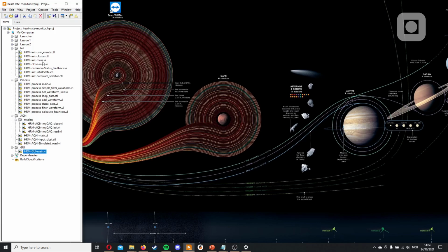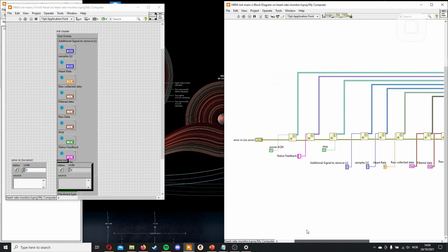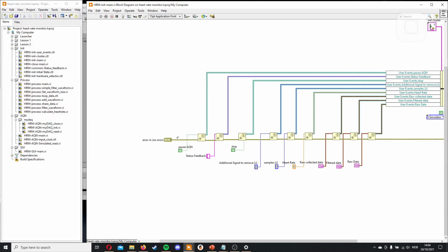We'll start as always by going into the initiation and creating a new user event. This will also be a boolean, and remember to change the name. Clear waveform data, let's call it that. Put it in here.